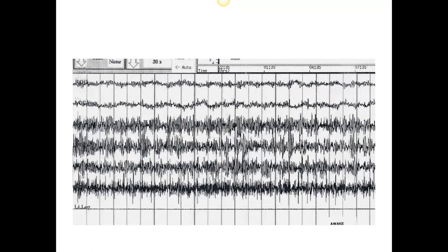Here is another close-up version of wake stage. Again we have our right eye and our left eye, these three EEG channels and the chin. Those are that alpha rhythm, which again is defined as a frequency of 8 to 13 hertz.